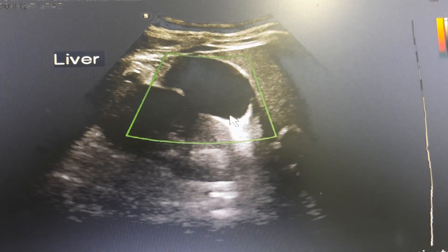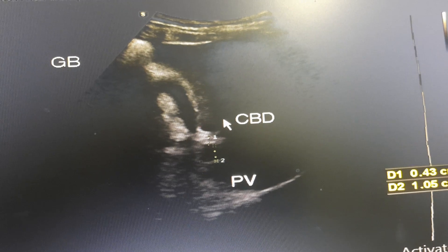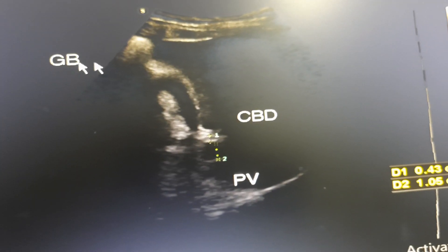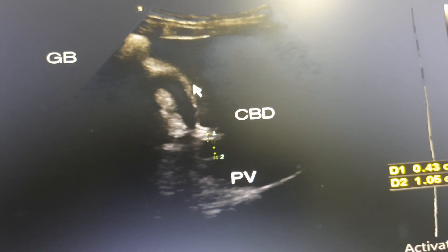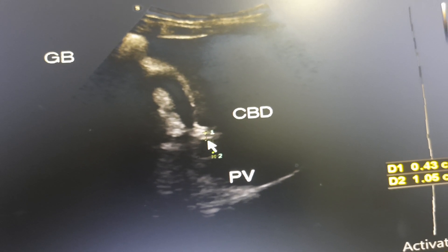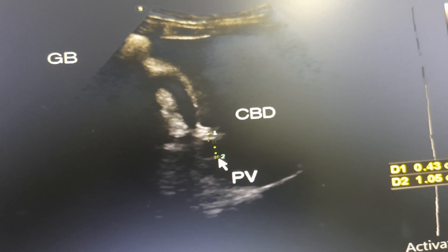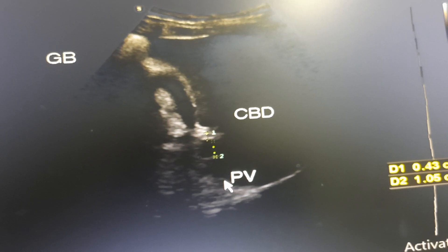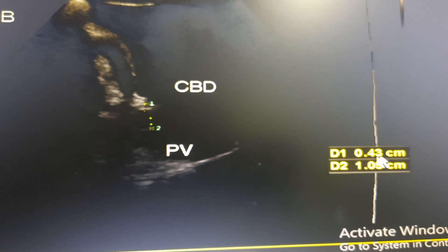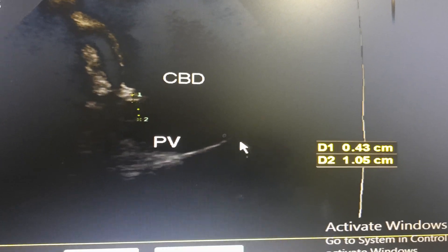And another one. This is the gallbladder. This is the common bile duct and this is the portal vein. This is their corresponding measurement.